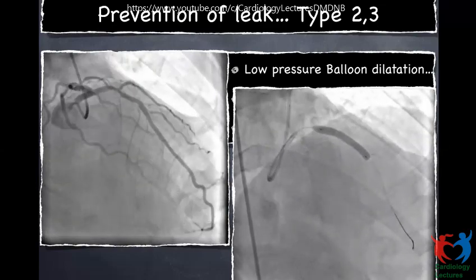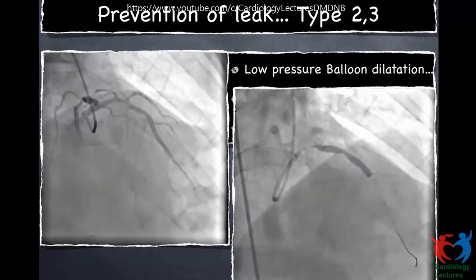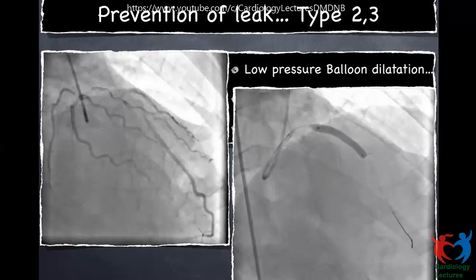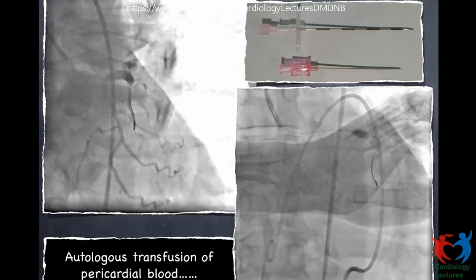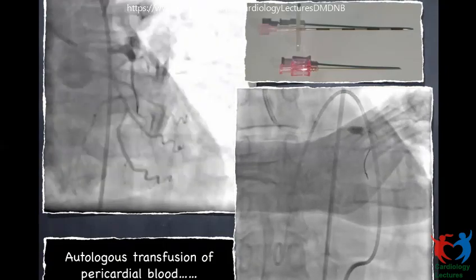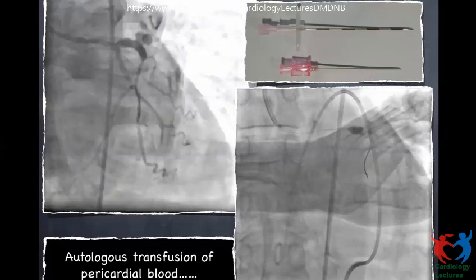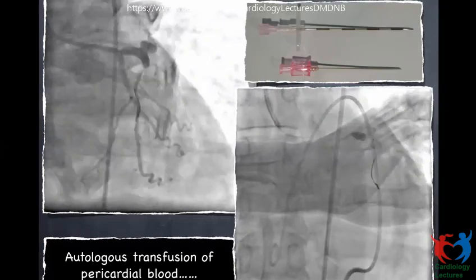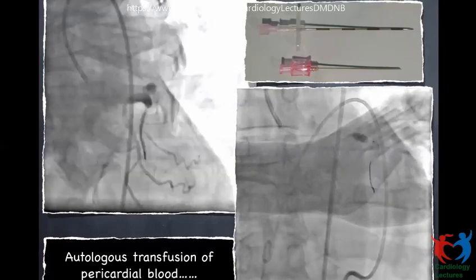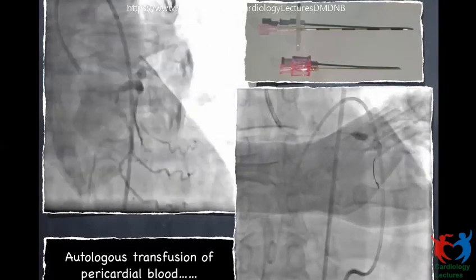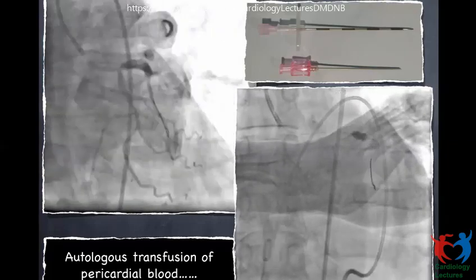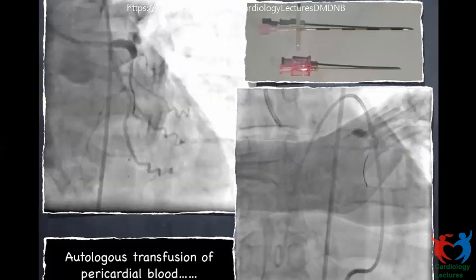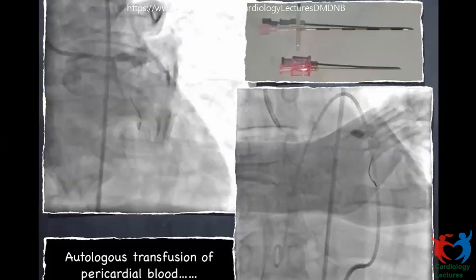He deployed the stent and removed the balloon. Once the balloon came out, the patient had cardiac tamponade, hypotension, and cardiac arrest. CPR was started. Fortunately, the wire was still inside the LAD and had not been pulled out. We immediately took a 4 mm balloon and inflated it at 6 atmospheres in the proximal portion. We also disengaged the guide catheter, primarily because we were trying to partially reverse the heparin effect with protamine — which can cause clot inside the guide catheter if it remains engaged.